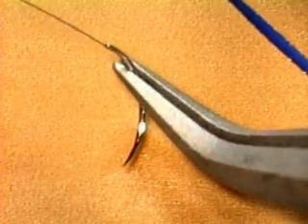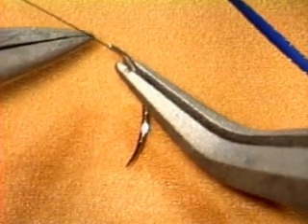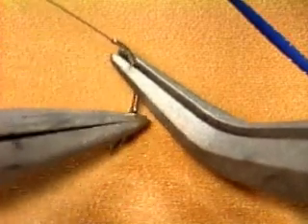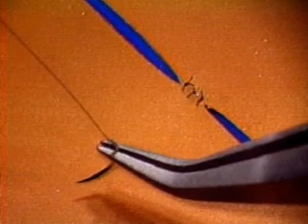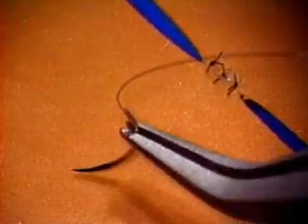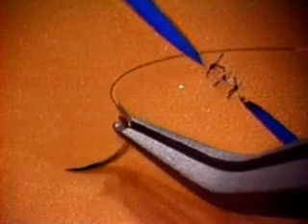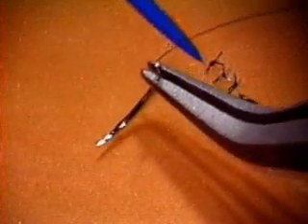Once you've picked the needle up, if you find it's tilted on its horizontal axis, you can correct that by giving a light touch here or here with your other pair of forceps. You can also correct malrotation in either plane by this simple maneuver. Let's see that again. Touch the underside of the needle on the underlying surface and drag the needle backwards while momentarily slackening your grip.